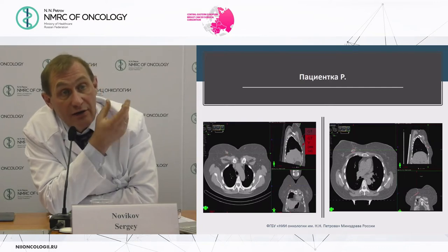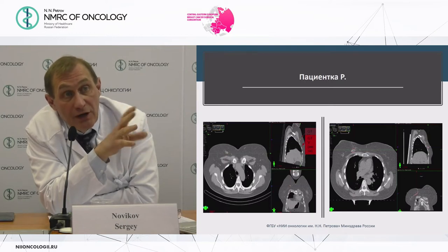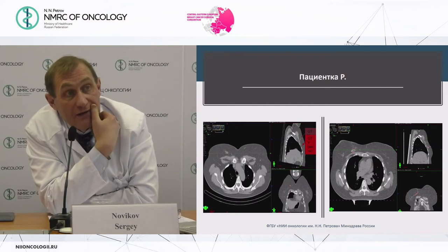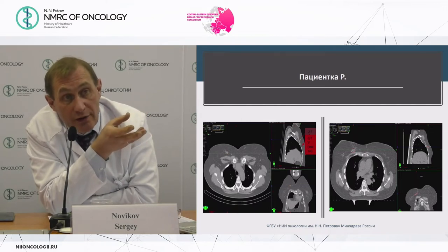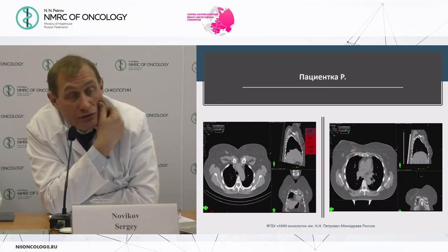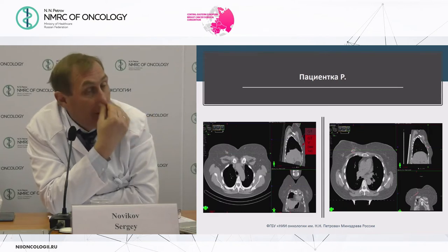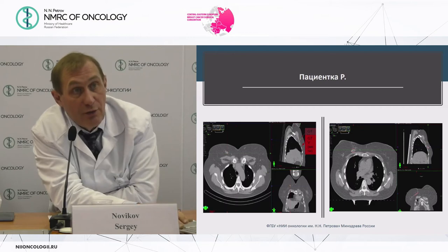we have the scar, which is also located near the clips. We have the clips, and if you tried to use the projection of the tumor to include it in the volume, it would be very, very big. It would be huge, and we would switch from partial breast irradiation or booster irradiation to nearly whole breast irradiation. And this is the question for us.